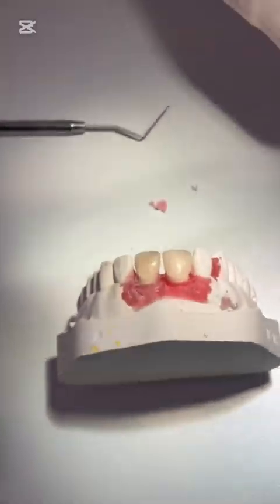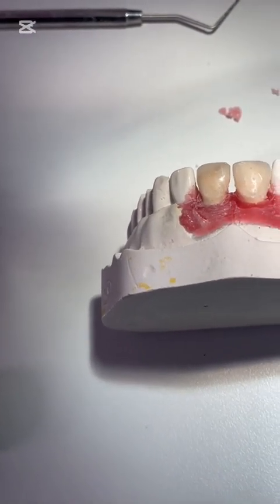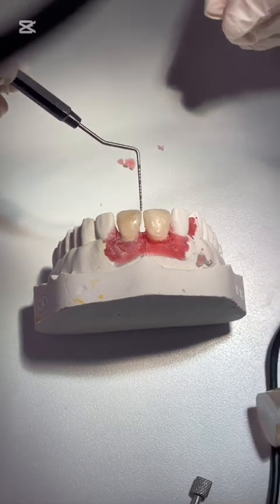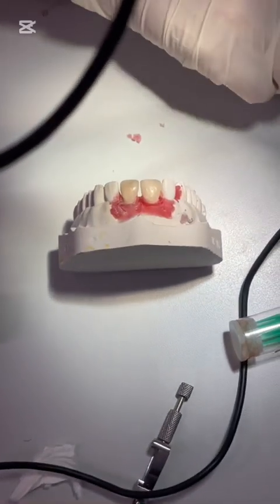I need some water. I said I have to reduce about 0.5 millimeter from this tooth. I will do the reduction first.